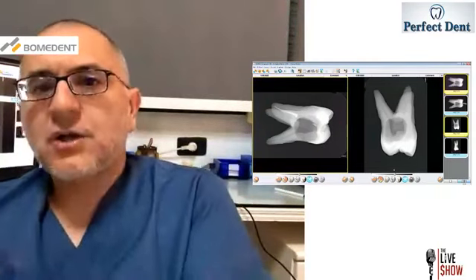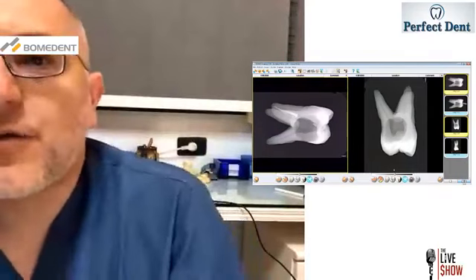What is relevant is how much of the canal has been enlarged. What has been the percentage increase? Have you increased 20%? Have you increased 30%, 100% of the original size? How much is enough?